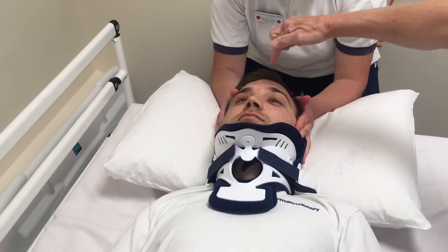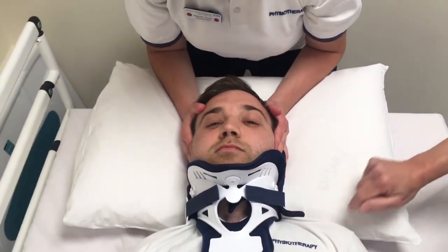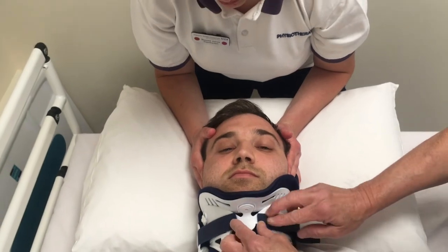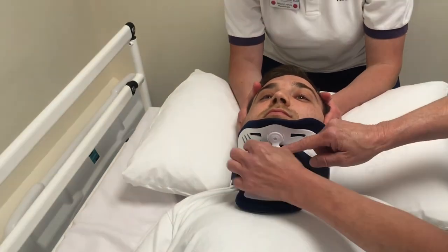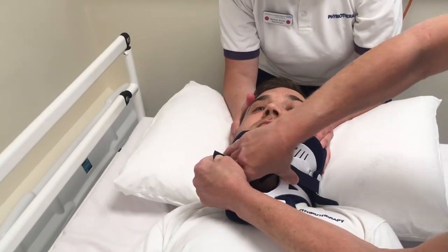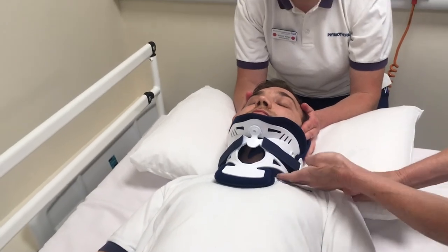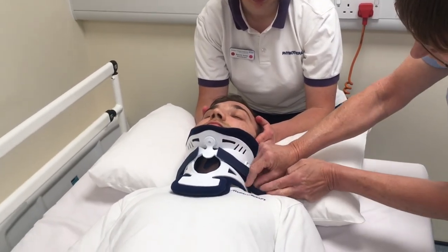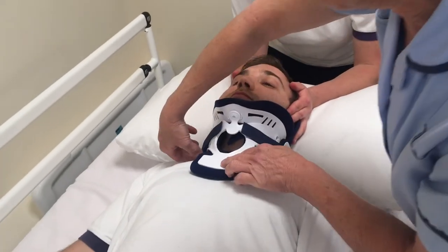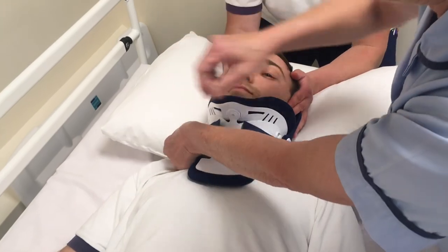Your colleague holding the head can look at alignment down through the chin and sternal pad to make sure that there's no twists, and also checking that the straps are horizontal and of equal length both sides. Also make sure that there's no skin against the white parts of the collar, and that you've got a good margin of blue all the way around.